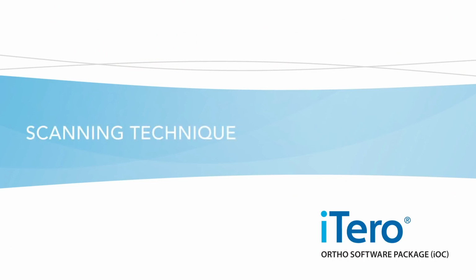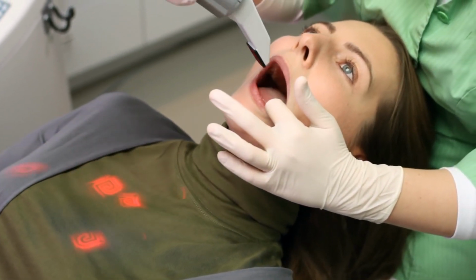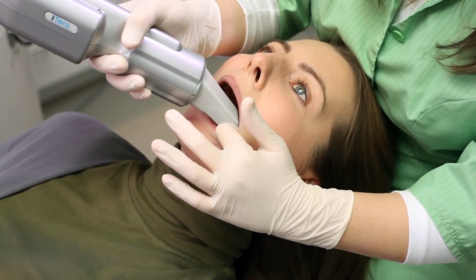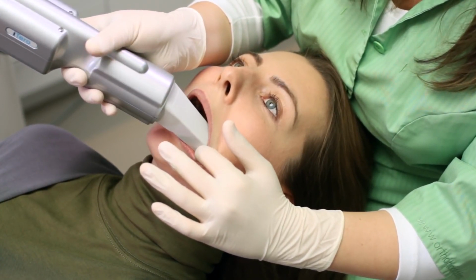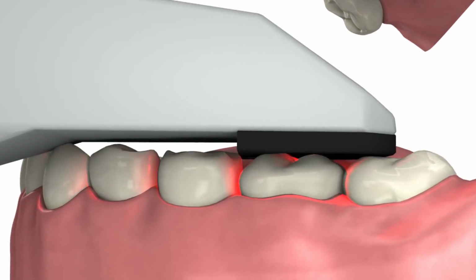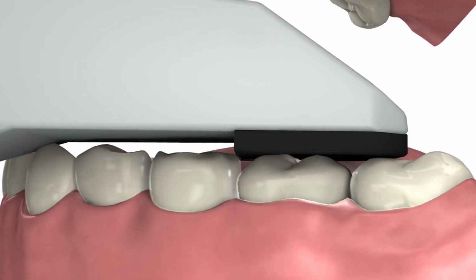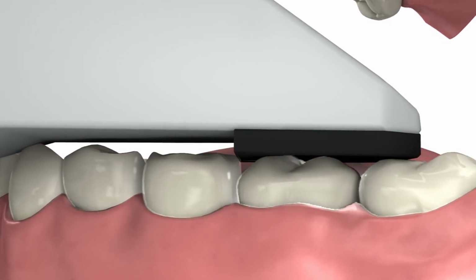Scanning technique. When approaching the patient for a scan, make sure you don't catch the patient's lip or cheek with the scanner. Instead, just gently pull the cheek aside and position the scanning head. The preferred method of scanning is to have the scanner touch the tooth surface. This will not cause the patient any discomfort.